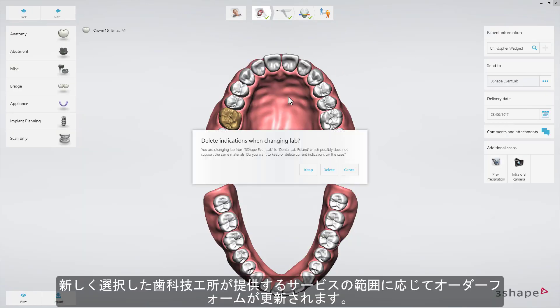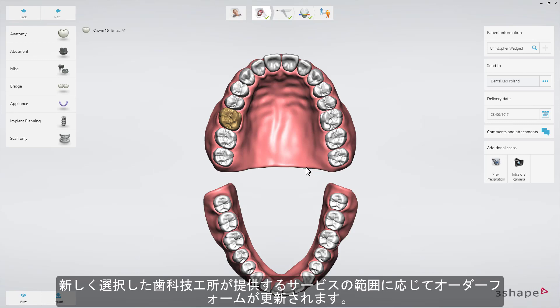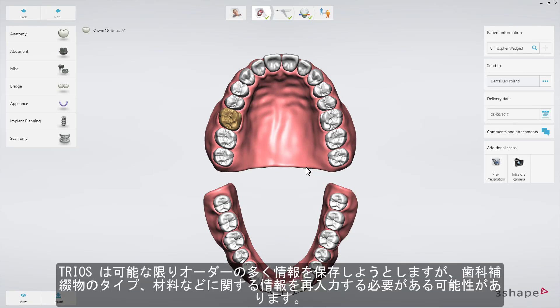Once the lab has been chosen, the order form will be updated according to the range of services offered by the new lab. TRIOS will try to preserve as much information as possible, but it may be necessary to re-enter the information regarding the restoration, such as type of indication, material, etc.